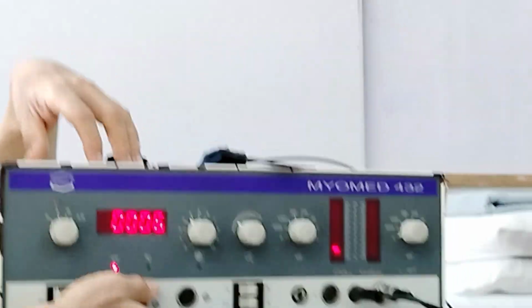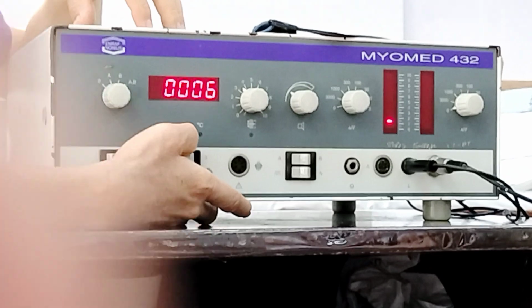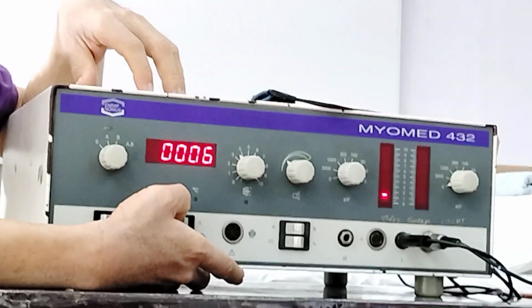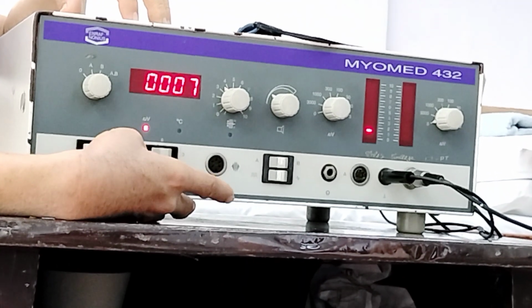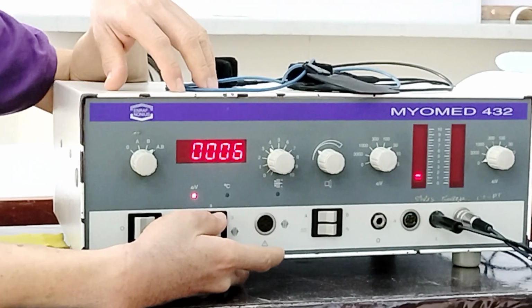Okay, so below here you have a selector switch. The unit here is in terms of seconds. So you're going to select your tool, either 0.3 second or 3 seconds. So that's the selector switch.